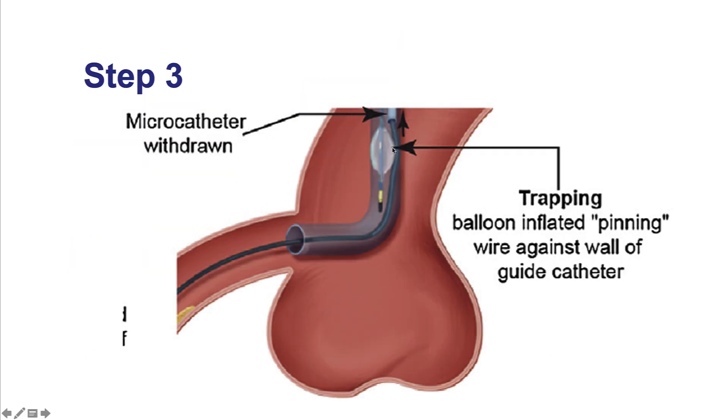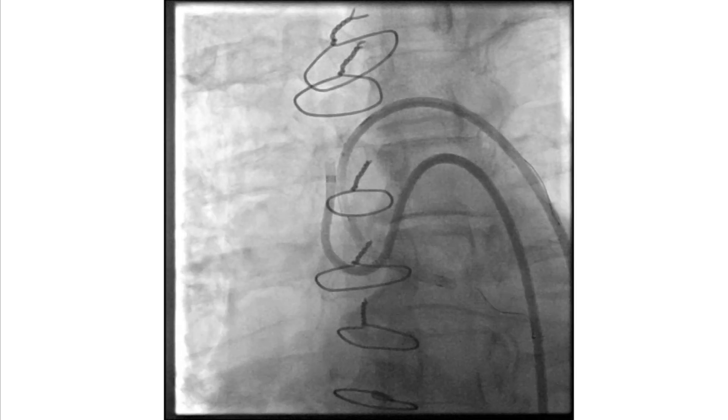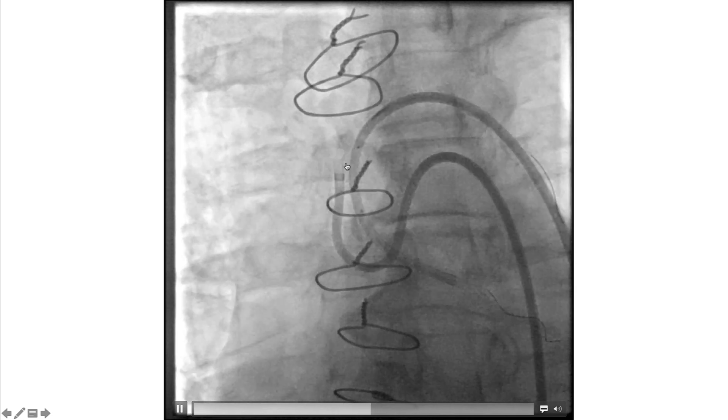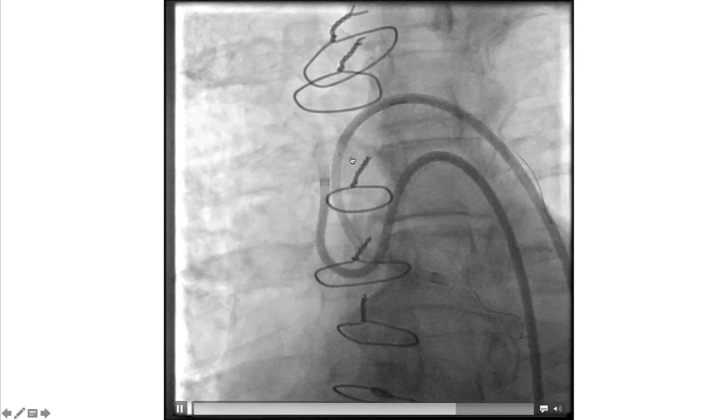The third step is to inflate the balloon, typically at 15 to 20 atmospheres. This pins the guide wire against the wall of the guide catheter. Then we can withdraw the microcatheter, performing fluoroscopy for the initial second or two during withdrawal. If the guide wire position is stable, there is no need for continued fluoroscopy. The balloon is inflated, it immobilizes the guide wire, and now the microcatheter can be removed without moving the tip of the guide wire.